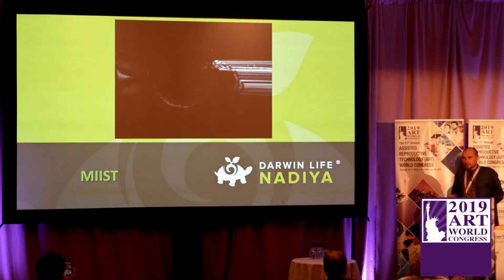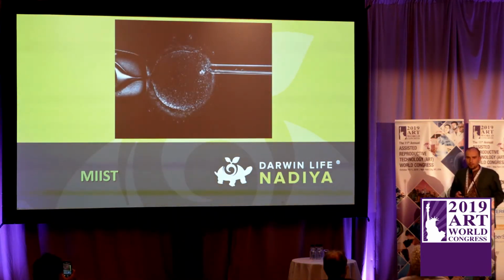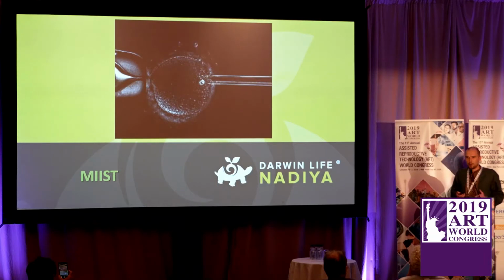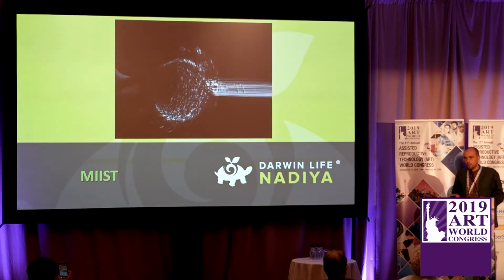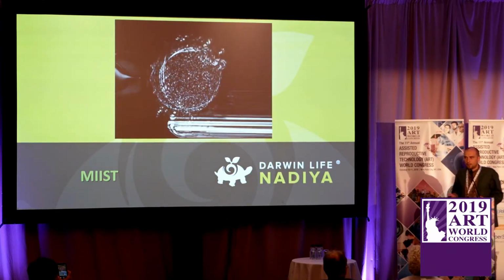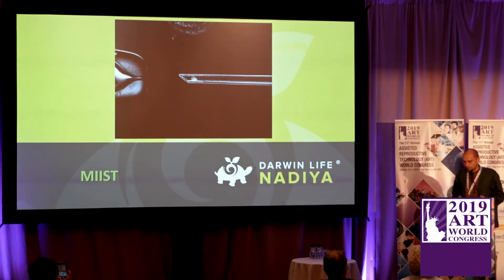There are publications that say that while you perform an M2 spindle transfer, you will have abnormal fertilization. It's much higher than in a control group, but that's not what we've observed in our experiments. We've performed this procedure under proper conditions, so we have normal fertilization rates, normal blastulation rates, and so on. So I think it depends on the conditions under which you perform this procedure.